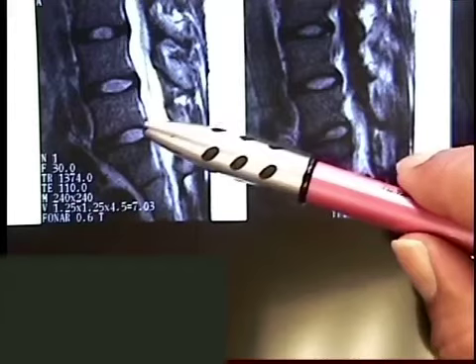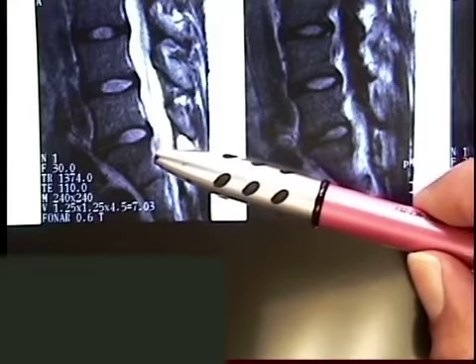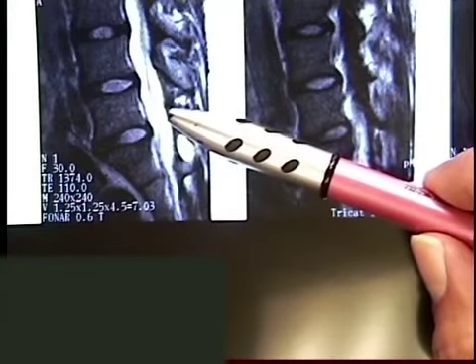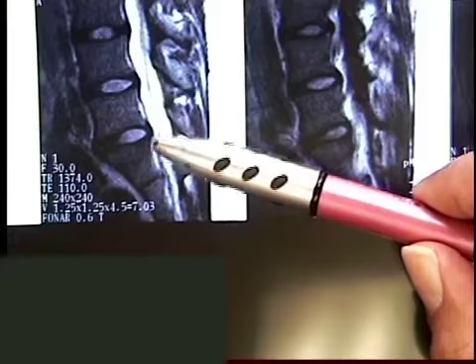Even the disc that is bulged is not degenerating. It's still got a bright white signal to it. The first thing that happens when you start degenerating in your disc, you lose the bright white signal. Water lights up bright white — you see the spinal fluid, a lot of water in your spinal fluid, lights up white. The disc, the first thing that happens when they degenerate, they start to dry out.